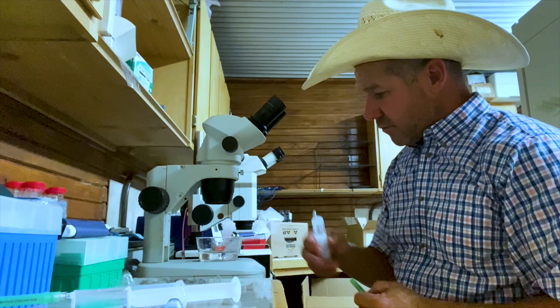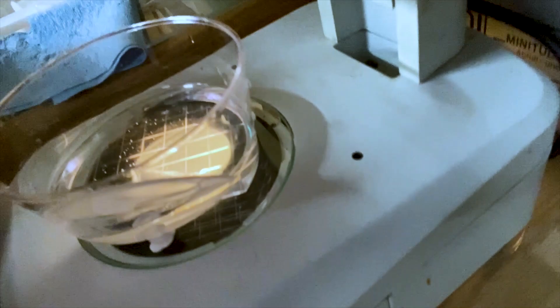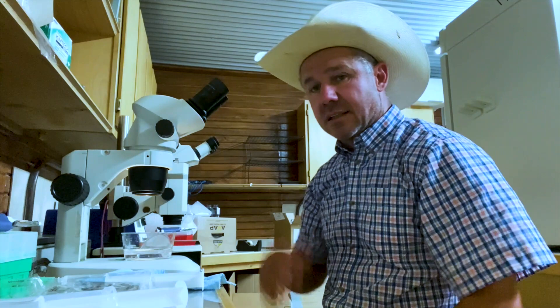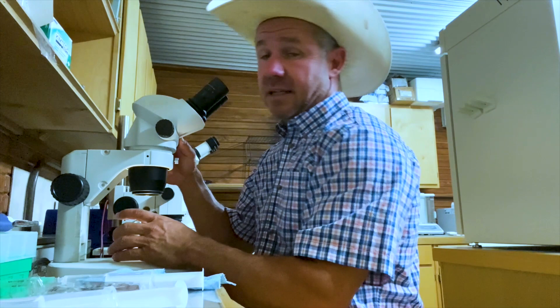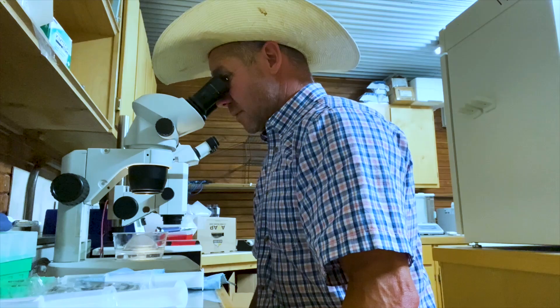Now we've got the filter here on the scope. There's no big hurry — you kind of have to let everything settle, let the embryos settle down. This is the filter and that's a grid, which kind of guides where things go. The embryo is slow to float down to the bottom, so just giving it a minute. A lot of times if it's a day eight embryo you can see it with the naked eye — even day seven. Got one! Got a day seven. So we're good to go.